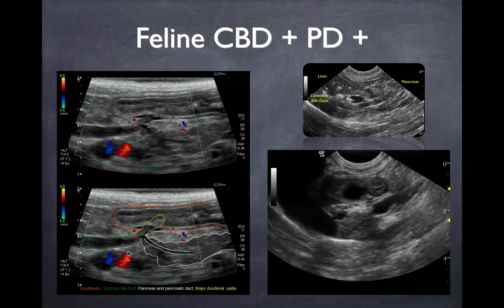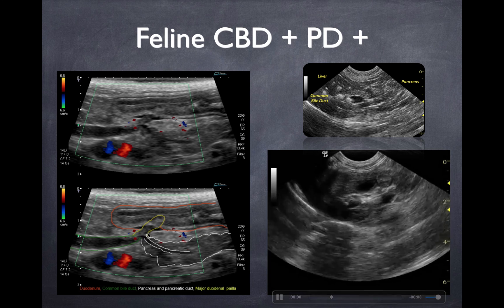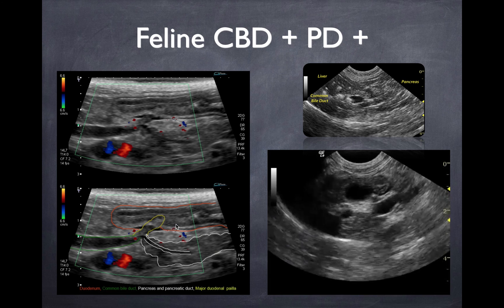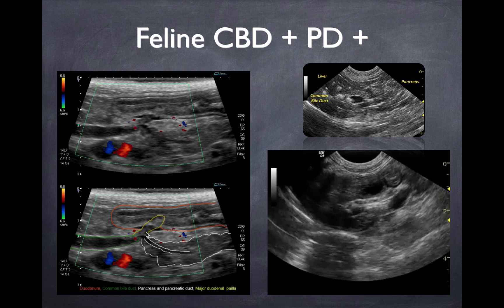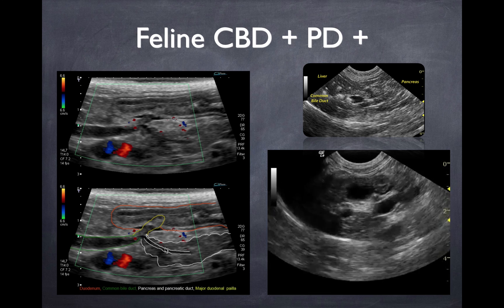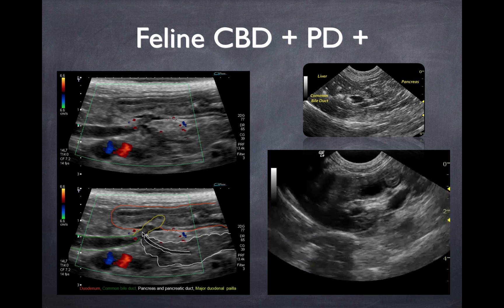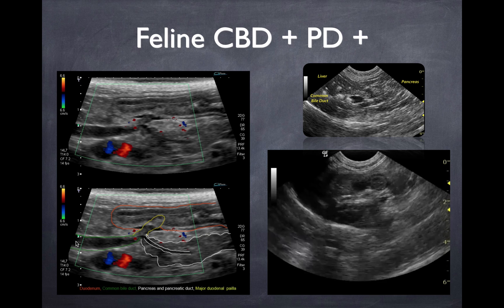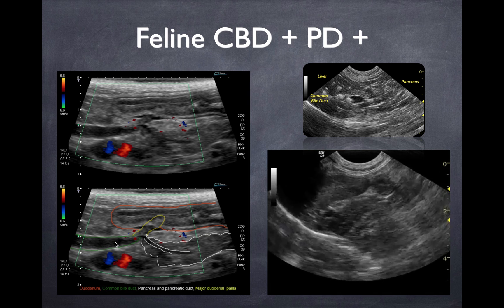You need a passive push to get into this area and evaluate. This is pretty normal, maybe with a little increased echogenicity of the duodenal papilla. But you can see that if you have duodenal disease it's going to obstruct this. If calculi lodge here, you're going to have dilation of both the pancreatic duct and the common bile duct simultaneously. If the obstruction is in the common bile duct only, the pancreatic duct will be normal, and you'll have post-hepatic obstruction pathology in the common bile duct up to the level of obstruction.